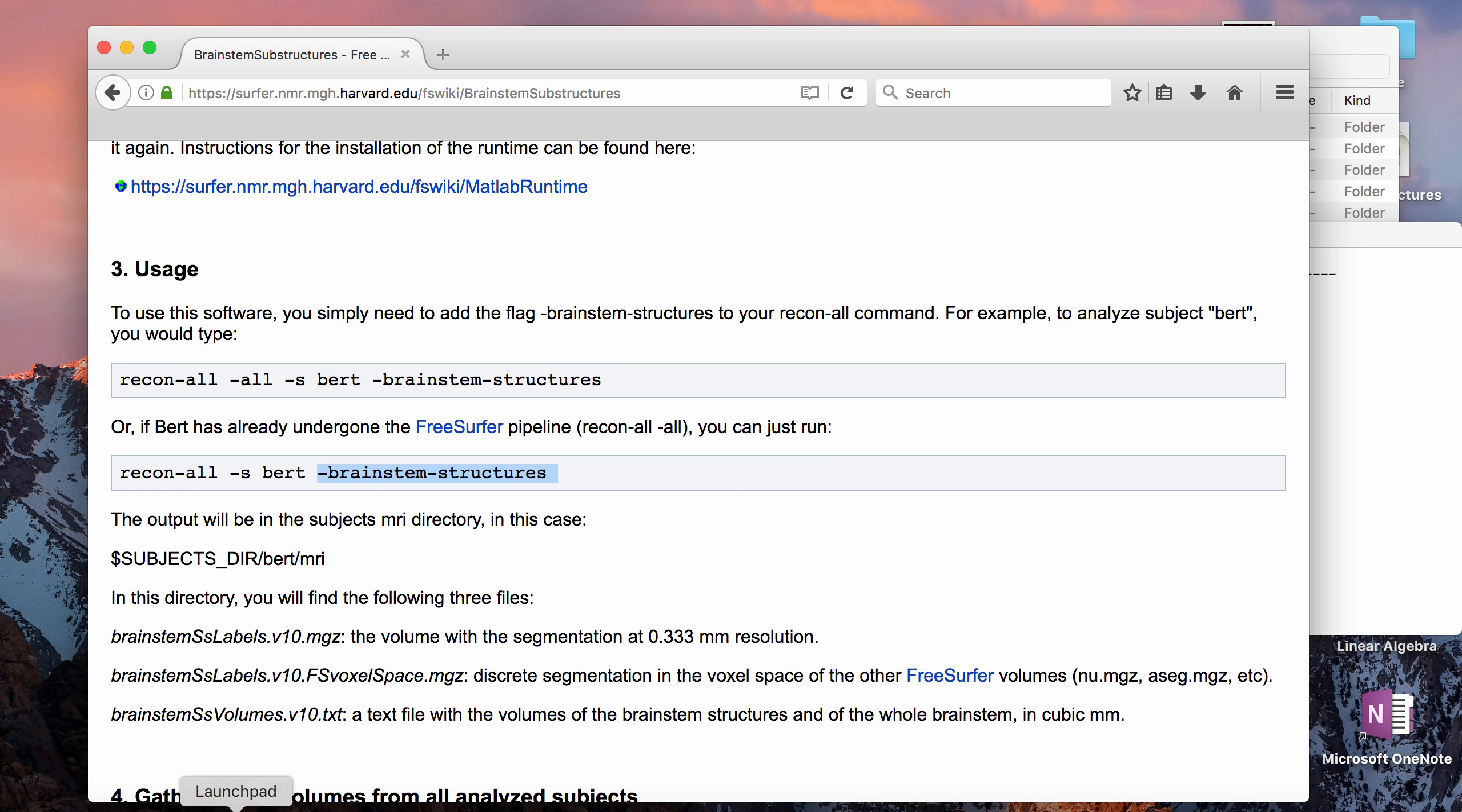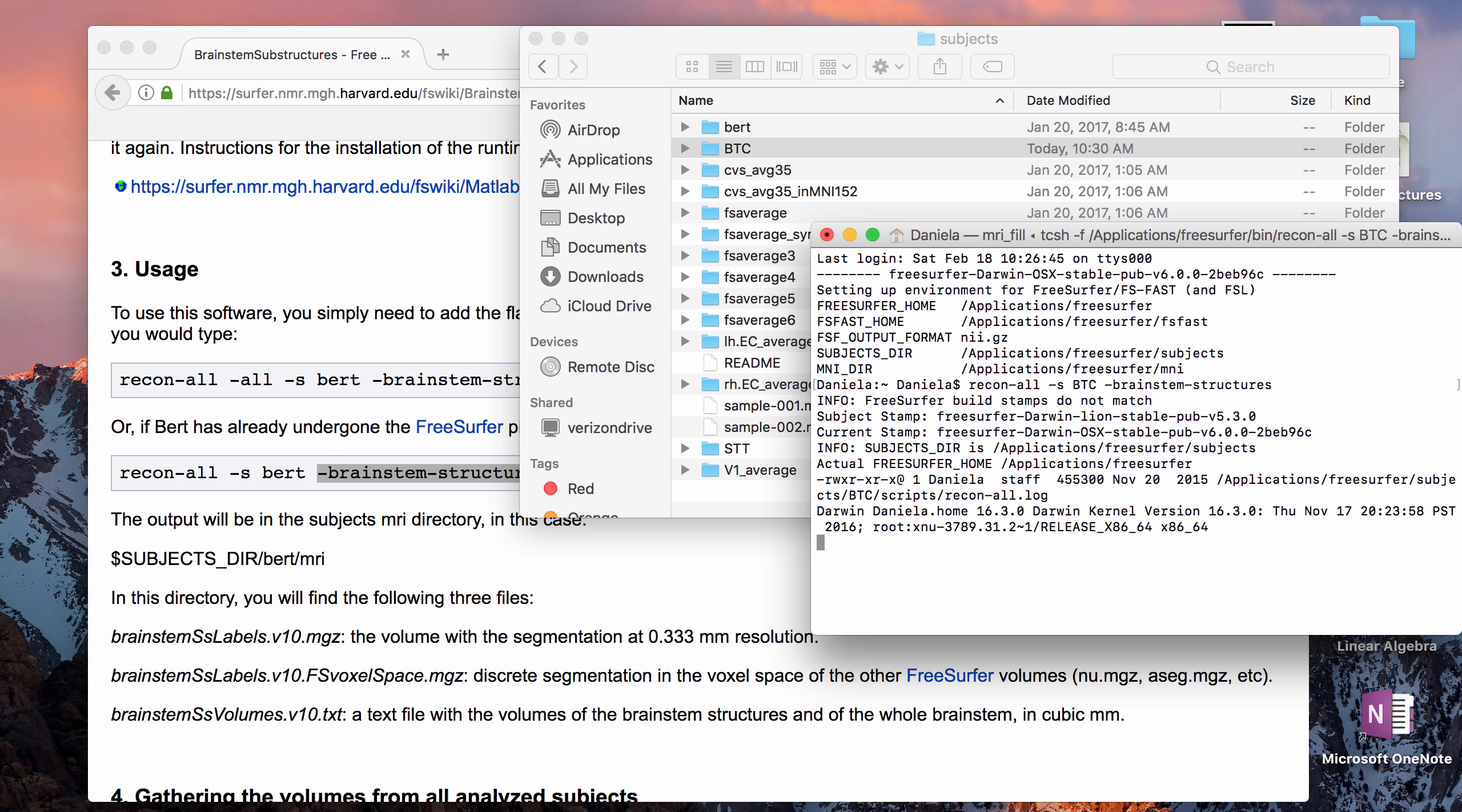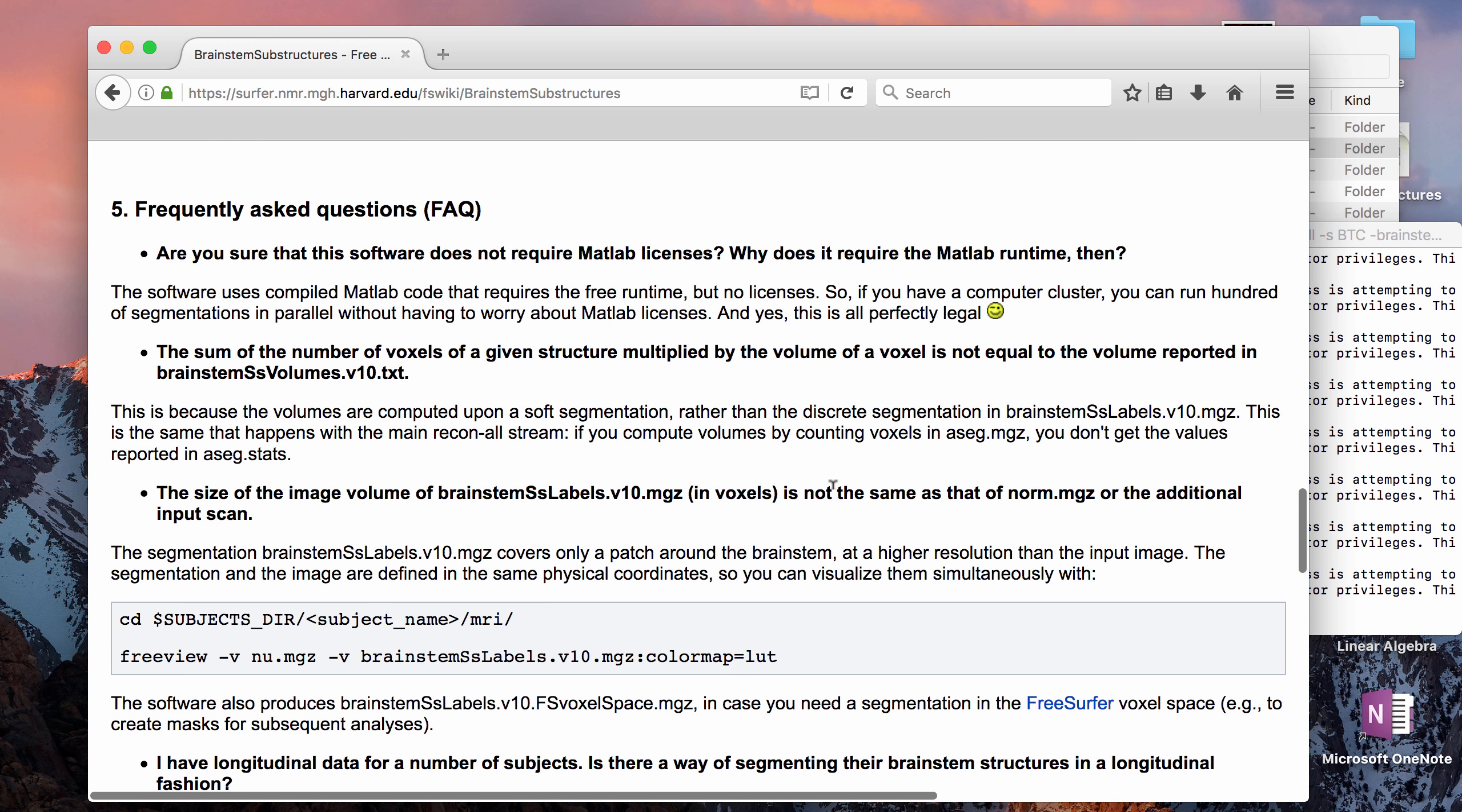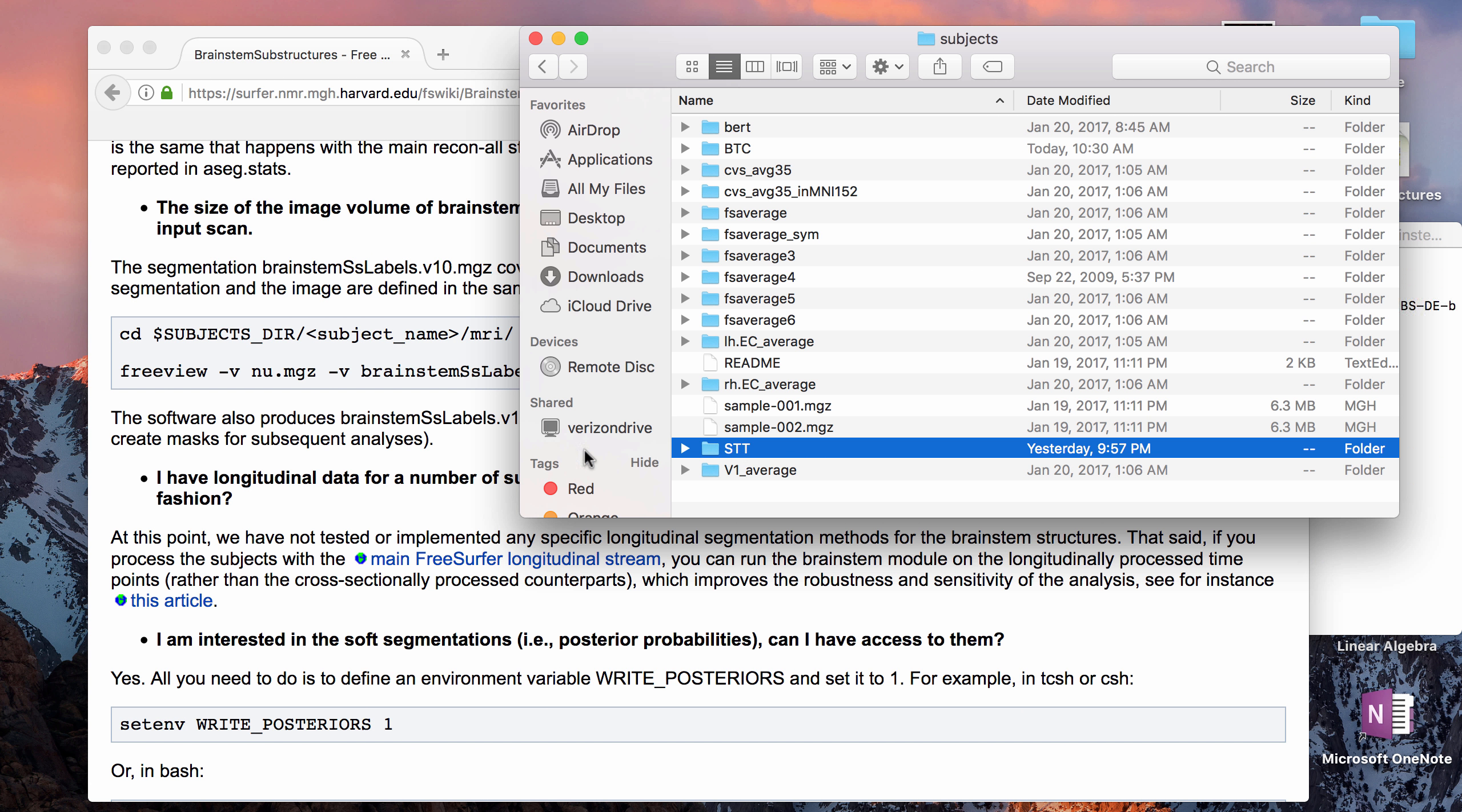I already did it for one subject, so let me go ahead and do it for this BTC subject which I have not done it for. So we're going to put recon-all, the name of the subject's folder which is BTC, and then brainstem-structures, and we're going to let that run. Like I said it should just take a couple minutes, and while that's running I will show you guys the output that I got from the other person that I did it on, which was my subject STT.